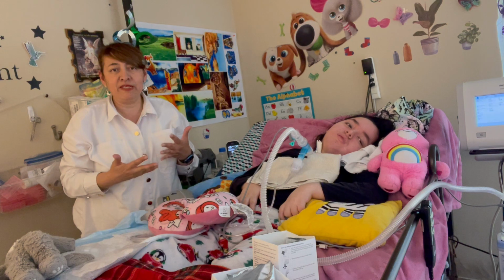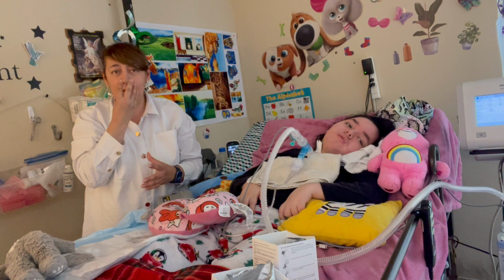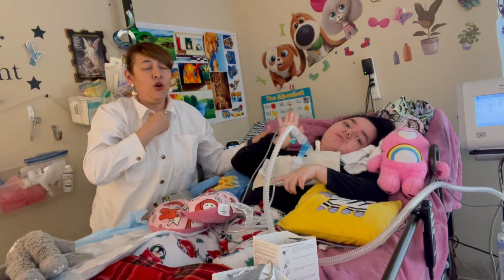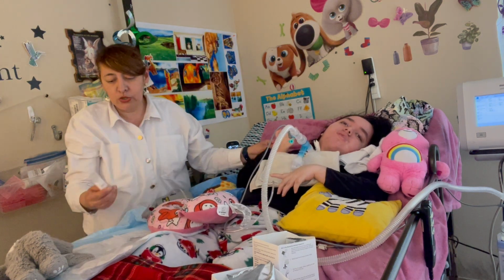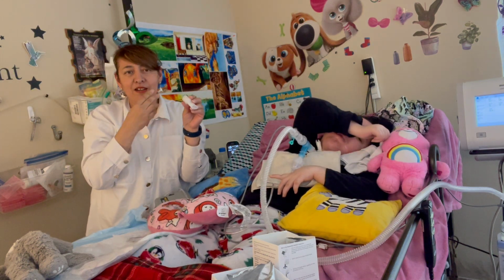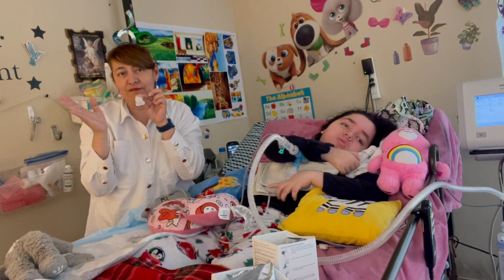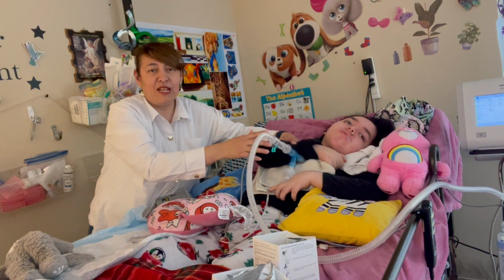When a patient is not on a ventilator, usually the nebulizer kit comes with a mask. I don't have a mask at this moment because she doesn't need it, but if the patient needs a mask, you put the mask on, and this cup is the same thing. Usually, people who don't require another device blow the aerosol by mouth, and that's it. But in my daughter's case, it's just as simple as this.